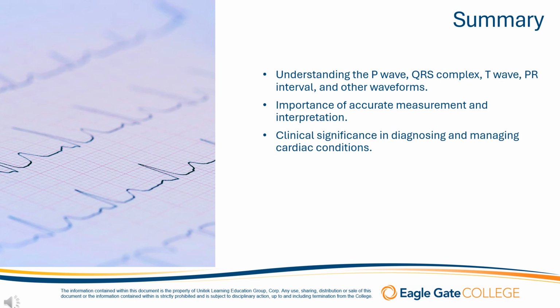Remember that there's lots of cardiac conditions we can diagnose or treat based on ECG. There's going to be arrhythmias, ischemia, and infarction, electrolyte imbalances, and we need to make sure that our ECG findings are guiding our treatment decisions, including medication adjustments and interventions like cardioversion or defibrillation. Regular ECG monitoring is essential for patients who have known cardiac conditions so that we can track progress, and detect any changes early.